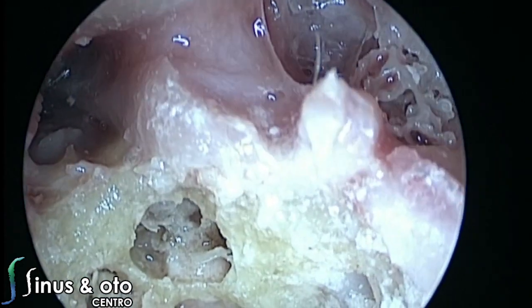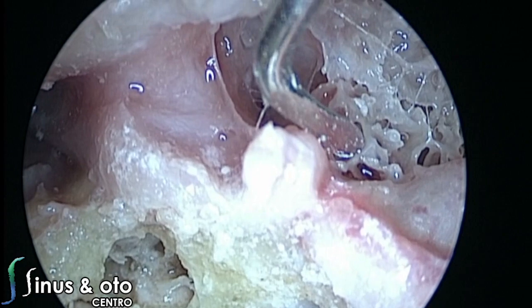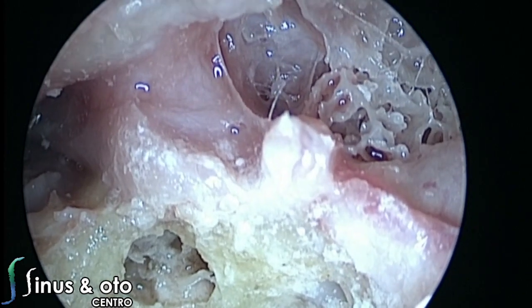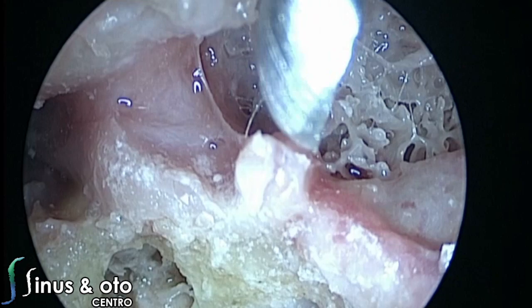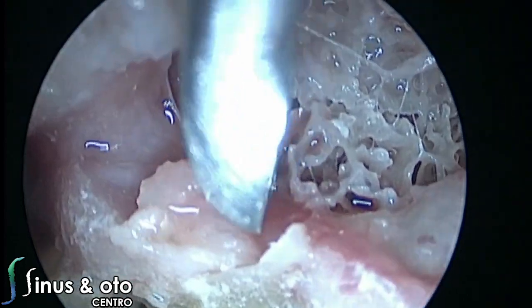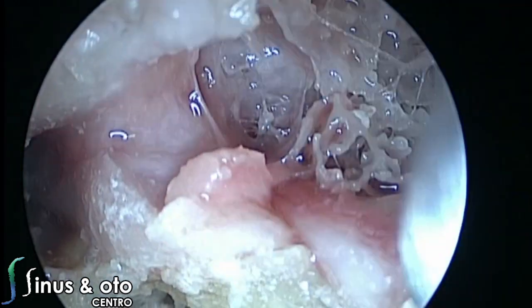So also we can see different things here in the anatomy, and one nice thing is to comprehend that the cochleariform process can be a very important anatomical landmark for the cog, of course, superiorly, that divides in some cases the supratubal recess from the anterior epitympanic space, and in some other cases the anterior epitympanic space from the posterior epitympanic space, and also the relationship between the tensor tympani muscle and the geniculate ganglion.